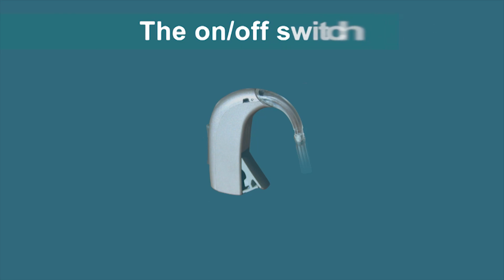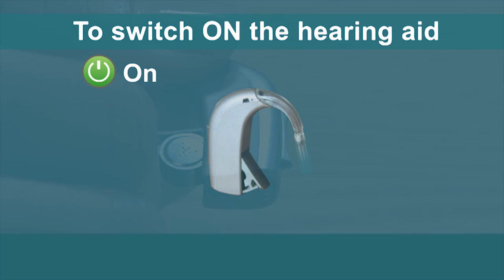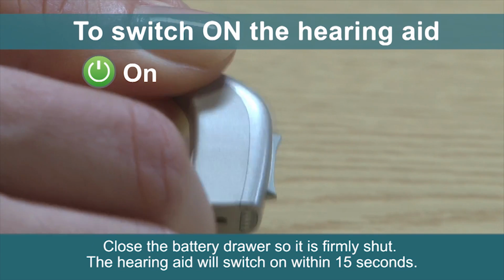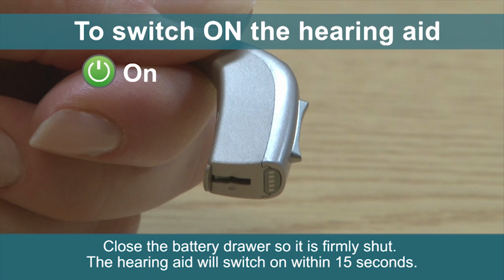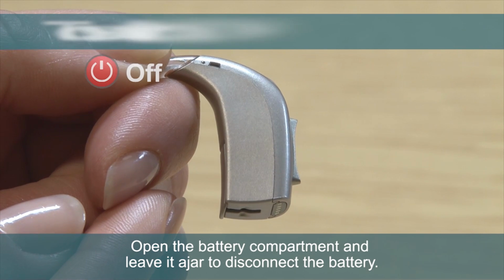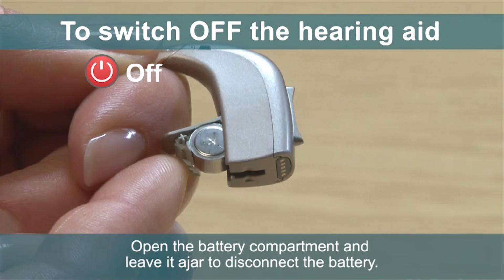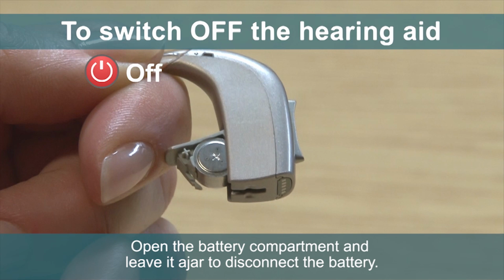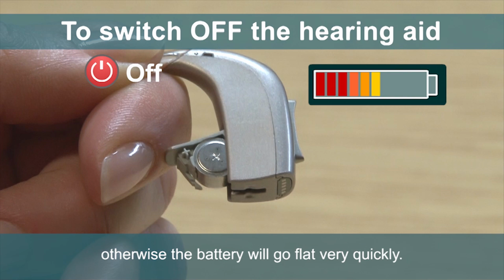The on and off switch. To switch on the hearing aid, close the battery drawer so it is firmly shut. The hearing aid will switch on within 15 seconds. To switch off the hearing aid, open the battery compartment and leave it ajar to disconnect the battery. It is important you do this whenever you are not wearing your hearing aid, otherwise the battery will go flat very quickly.